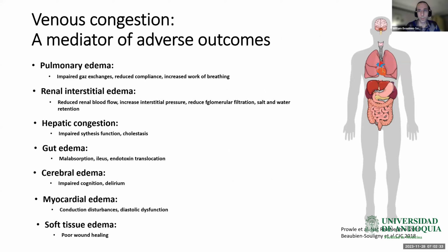And in multivariable models, each decrease of this renal venous stasis index between the index visit and the 1 month follow-up was associated with improvement in kidney function during this period. So this is a good reflection of the fact that when you find these signs, they probably rule in the possibility that this patient has an impairment in kidney function due to venous congestion.